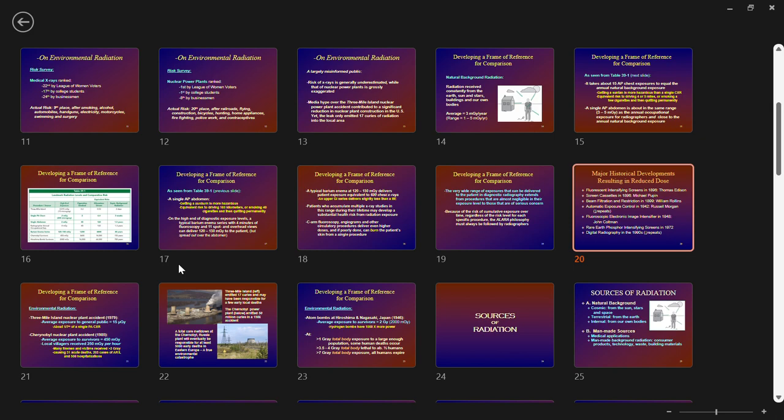The DR systems that we have now can produce almost equivalent images in resolution, better than the human eye can differentiate, but give you more contrast resolution too. So we're phasing out film for lots of different reasons. Okay.